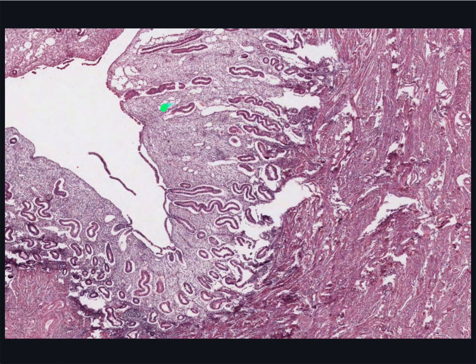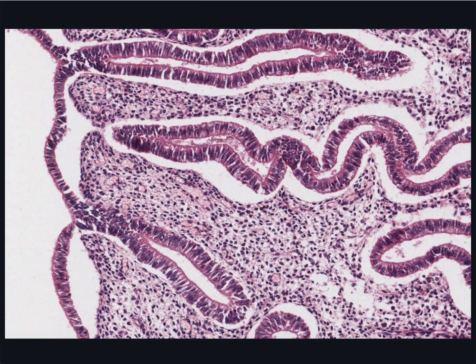The best indicator is the orientation of the glands. Those in the functional layer are running to the surface, and therefore in this section they're cut longitudinally. The segments of the glands in the basal layer are convoluted, and so they're sectioned in various orientations. Here the glands are narrow because they're not yet active. Their epithelium is tall, rather orderly, and columnar.